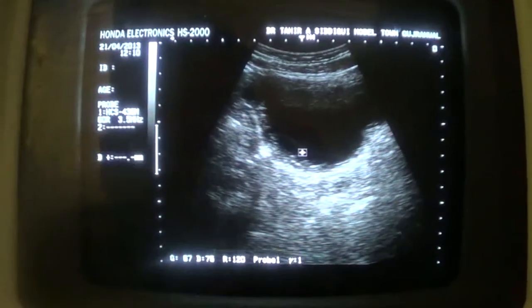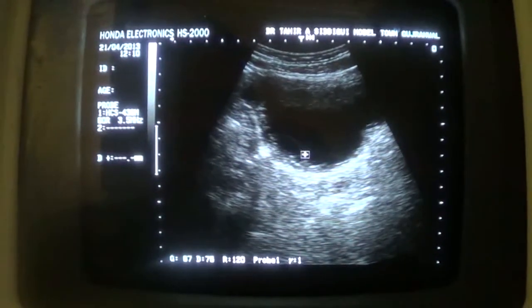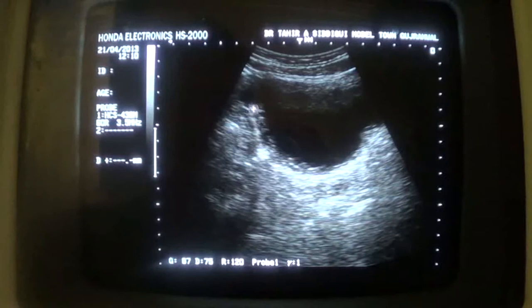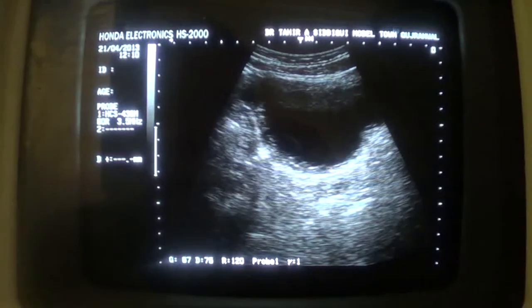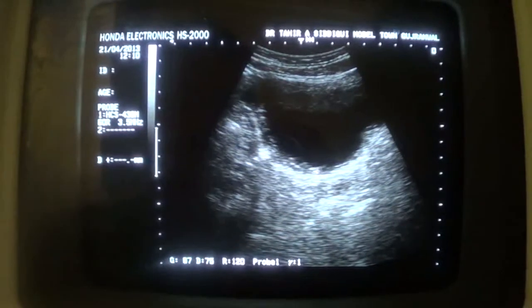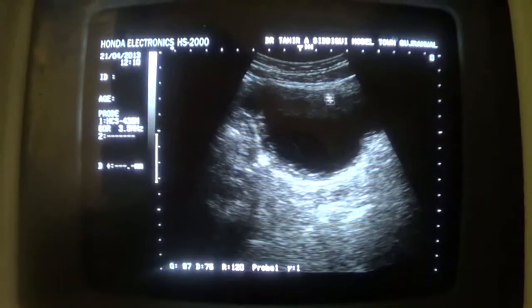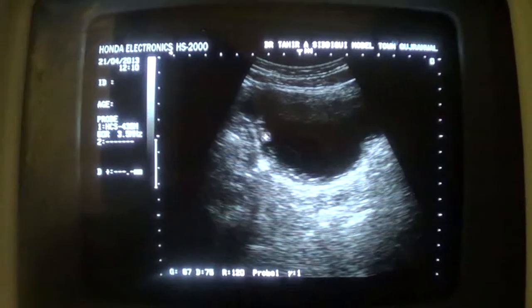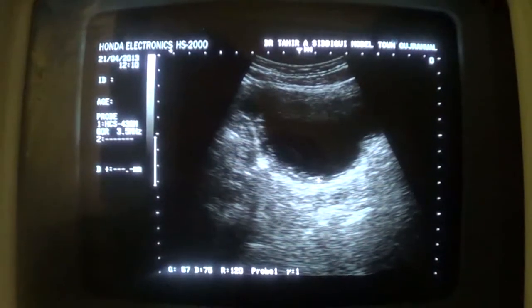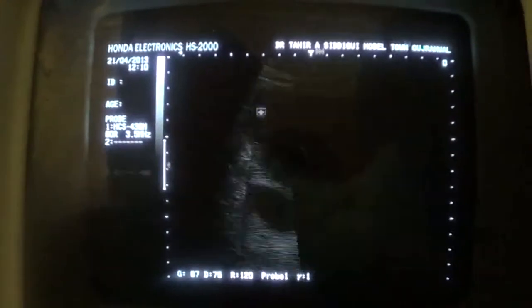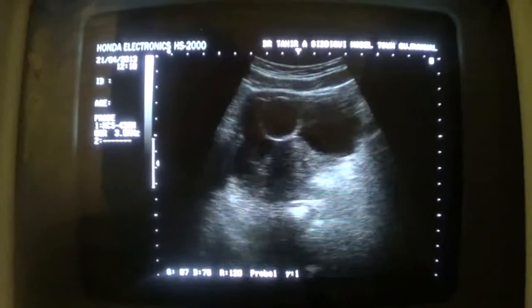You can see that the posterior wall is thick. Hypertrophic trabeculations are seen. This is the posterior wall of the urinary bladder and these are the hypertrophic trabeculations.